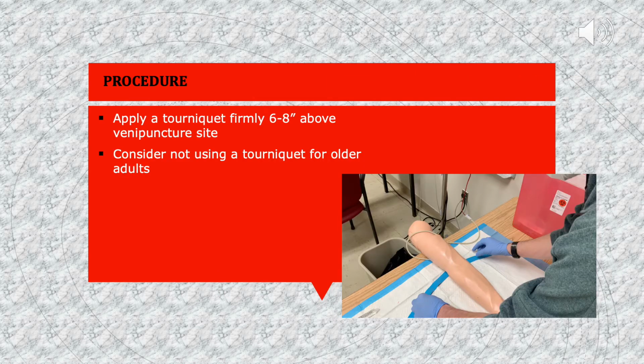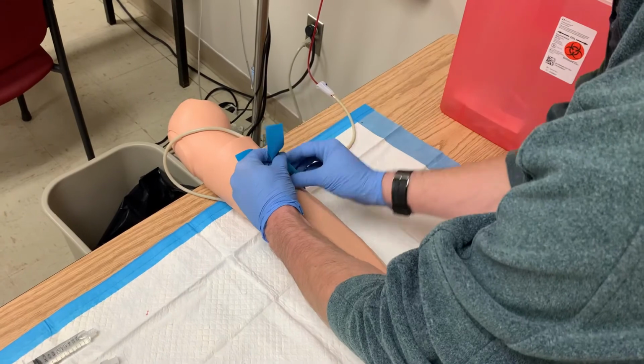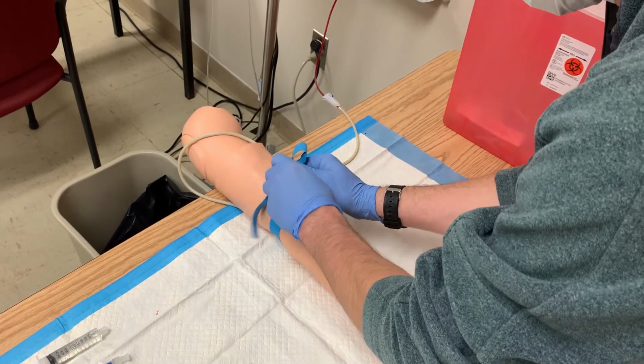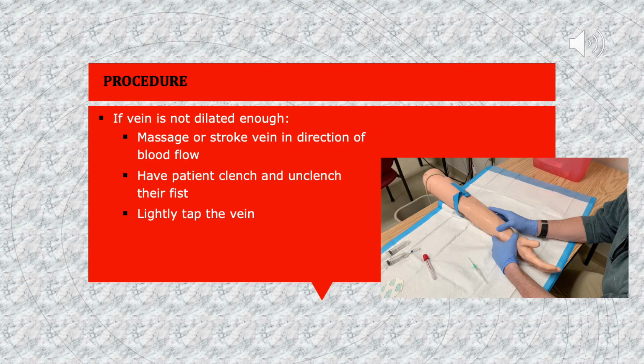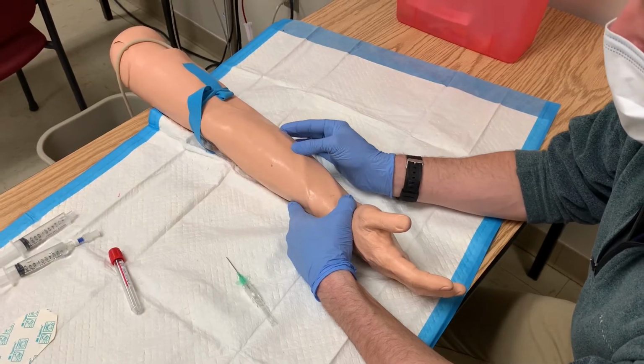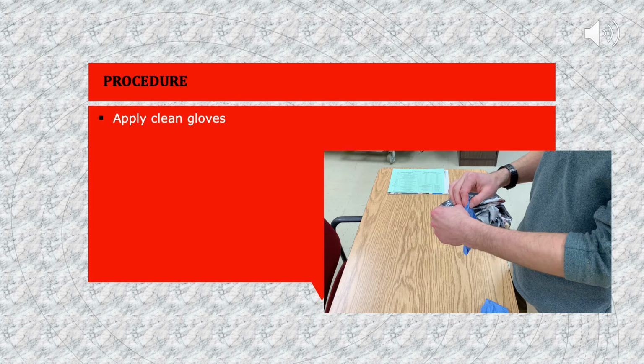Apply the tourniquet above the venipuncture site. Older adults with fragile skin may not require a tourniquet. Massaging or stroking the vein in the direction of blood flow may help it to dilate, as will having the patient clench and unclench their fist. Also, lightly tap the vein to distend it. Don clean gloves.